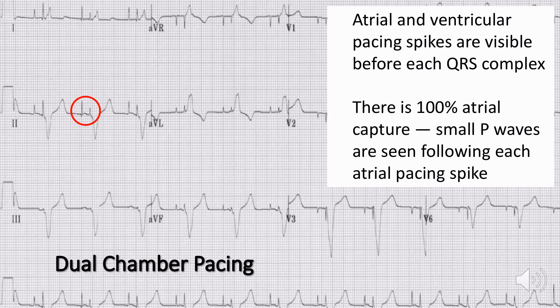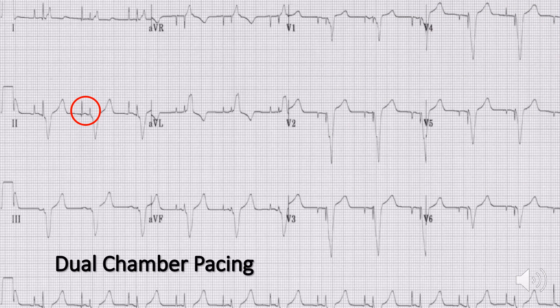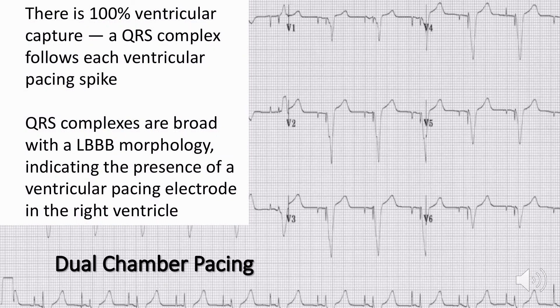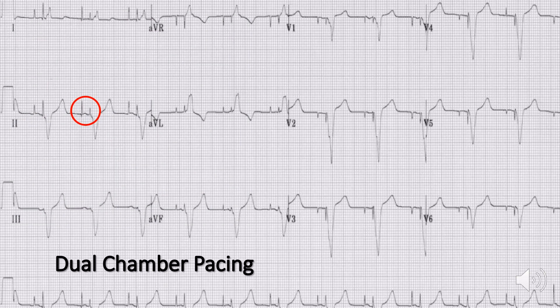The explanation for dual chamber pacing ECG changes: atrial and ventricular pacing spikes are visible before each QRS complex. From this ECG you can see 100% atrial capture, meaning there is a small P wave following each atrial pacing spike. You can also see 100% ventricular capture, meaning every ventricular pacing spike is followed by a QRS complex. The QRS complexes are broad with a left bundle branch block morphology, which indicates the ventricular pacing electrode was placed in the right ventricle.